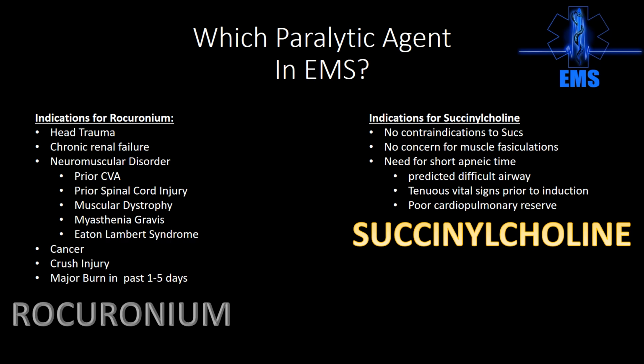I need to have reasonable success that I'm going to be able to accomplish this tube, i.e. the patient may still be a difficult airway, but I have figured out my plan, and I can successfully negotiate that plan, and I have got a plan for a backup and a backup. So we're already down the road of ET intubation, BIAD, and lastly, crike if this goes into a failed airway.